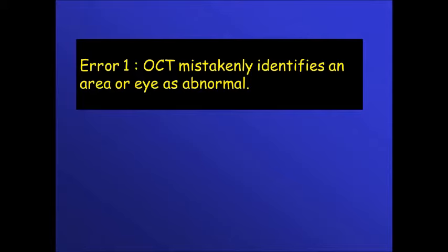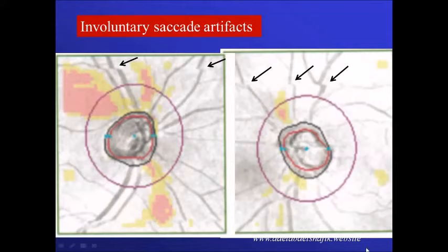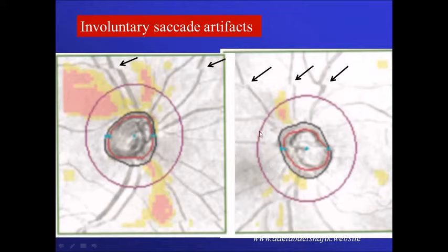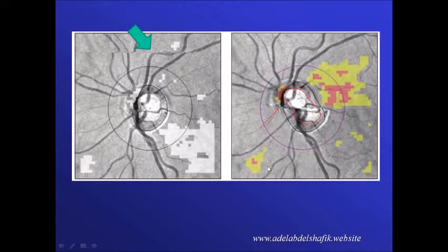The first type of error occurs when OCT mistakenly identifies an area or an eye as abnormal. One cause is saccadic eye movement, which produces interruption of blood vessel continuity. Once this happens, the 3.4 mm ring is no longer continuous — it is at one location in one area and a different location in another. You can see the vessel interrupted, so we cannot trust this area to be completely correct all around.